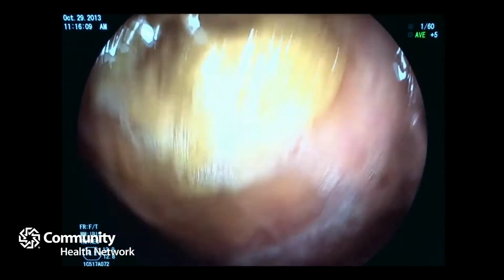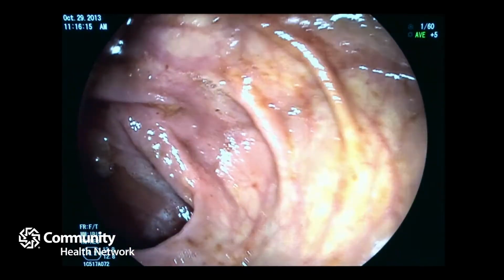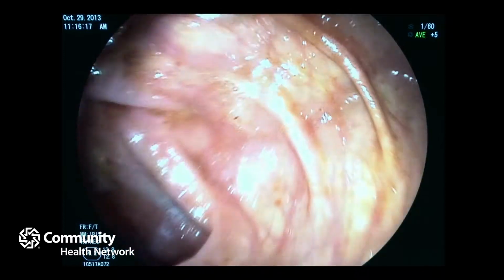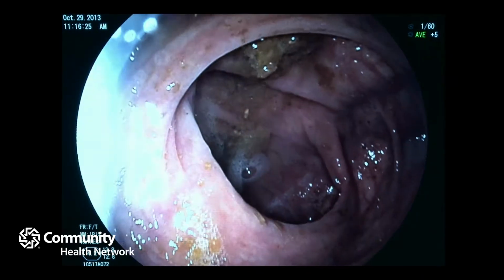Basically the wrinkles are the mucosa, the inner lining of the colon. Everybody's is a little bit different. Some are more pronounced. These are just little folds inside the colon. This big fat thing right here, that's where you know you're at the cecum. Sorry the view's not great. And then as I did before, I got into that ileum.